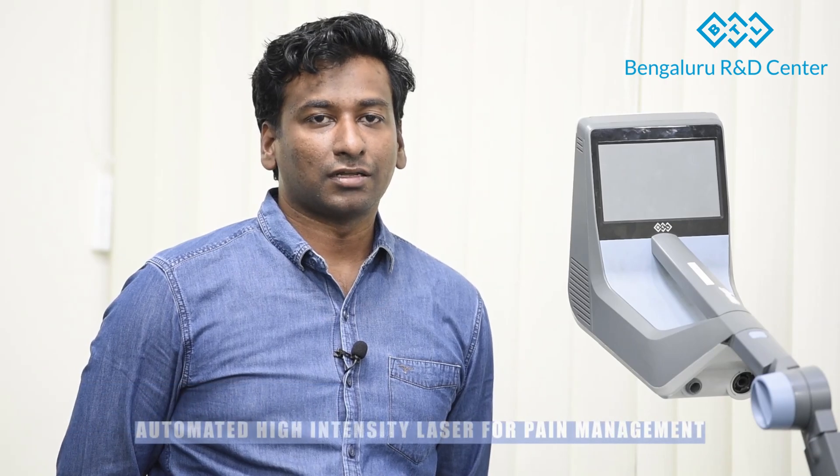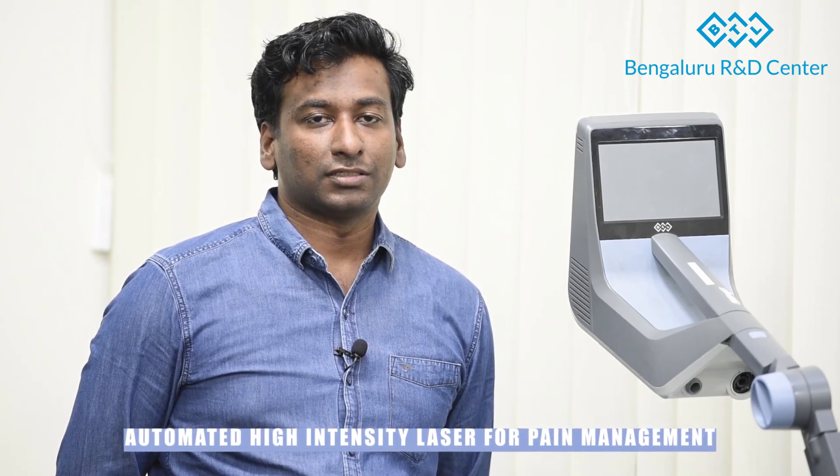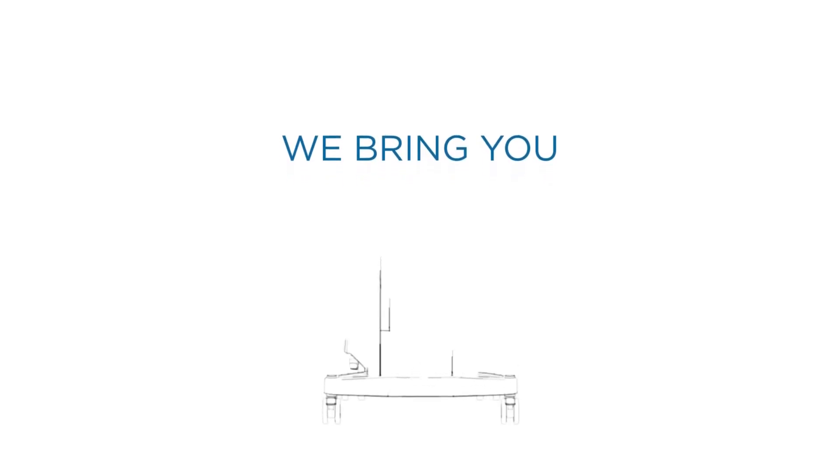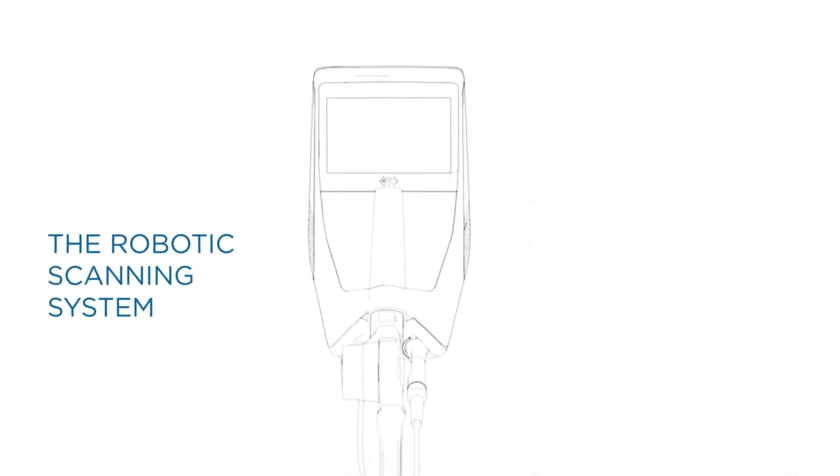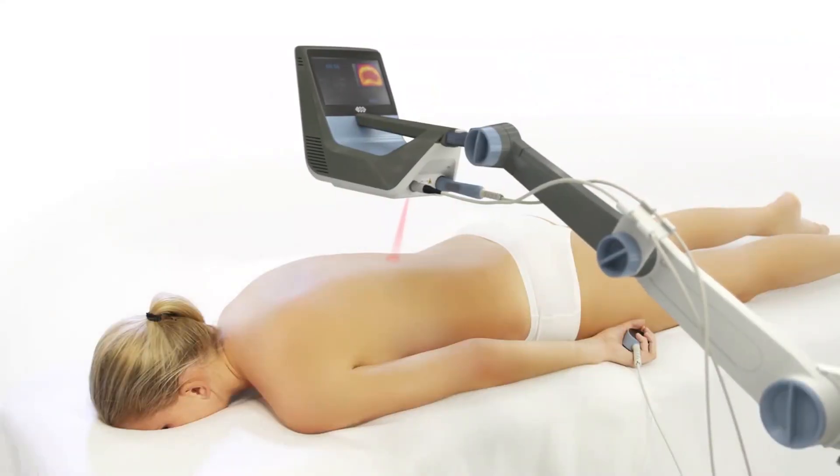Imagine if there is a fast, accurate, repeatable, effective, and safest way of delivering class 4 laser therapy without a doctor being present. Let me introduce you to the next generation in high-intensity laser technology, the robotic scanning system.